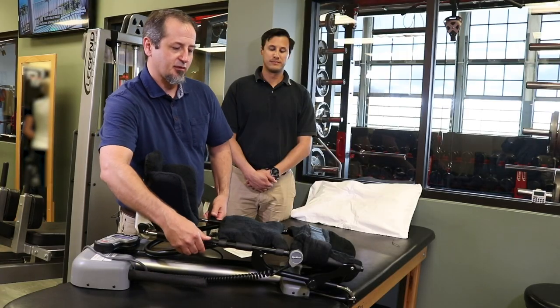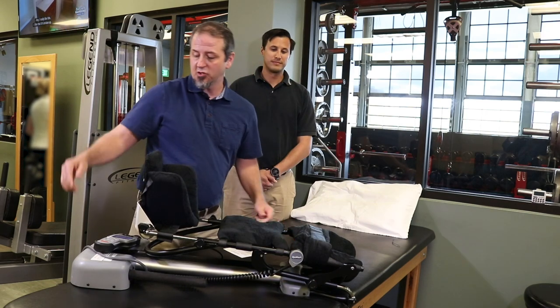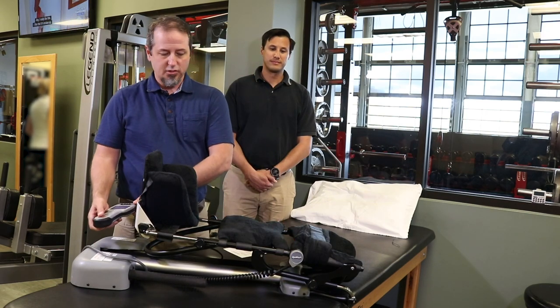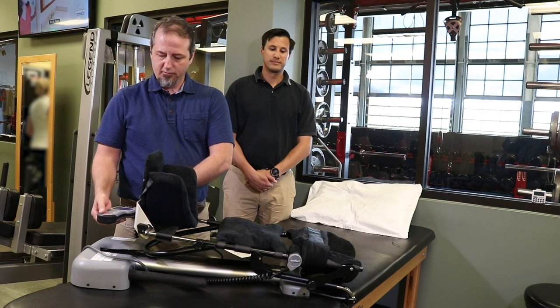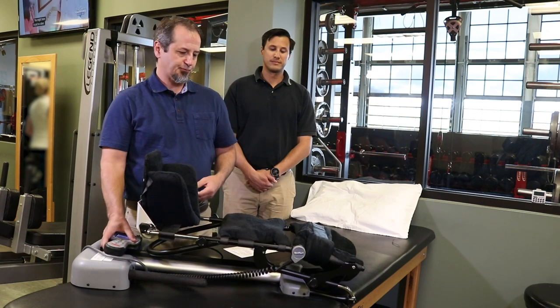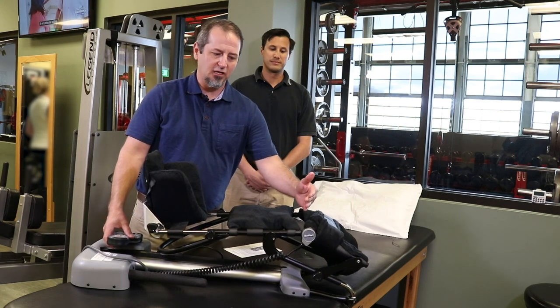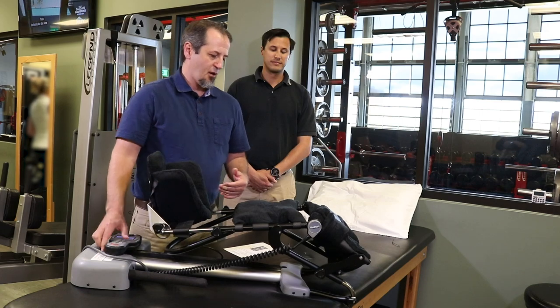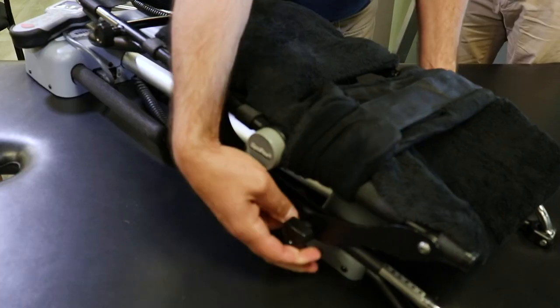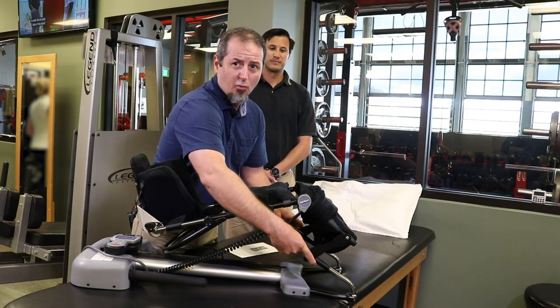If the patient is a little extra tall we can also adjust it down here on the femur section of the machine. To do that we would first raise up the angle of the unit — you can see where the bending occurs. That's why it's very important to line the patient's kneecap up with that pivot point. We can stop it and then bring this up by loosening these two bolts on the side, and that gives us a little more length and adjustability depending on the height of the patient.